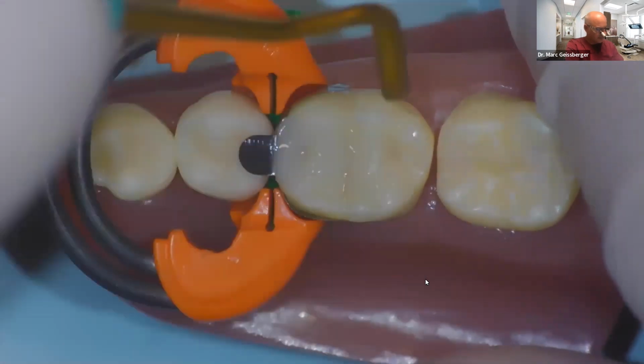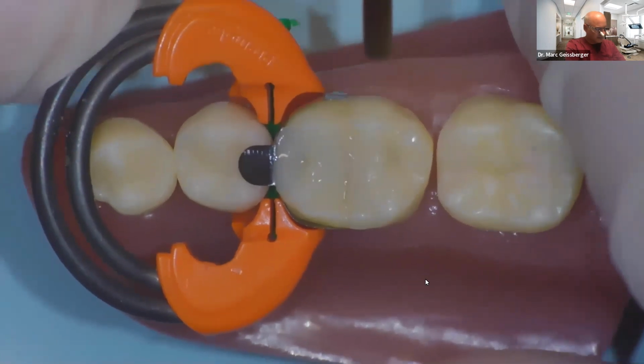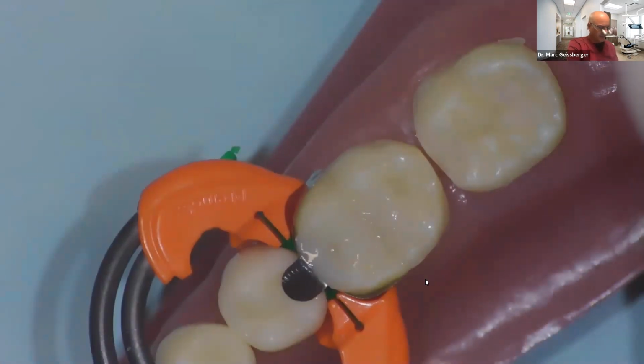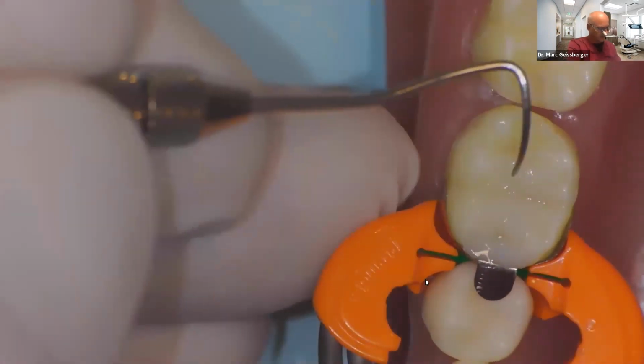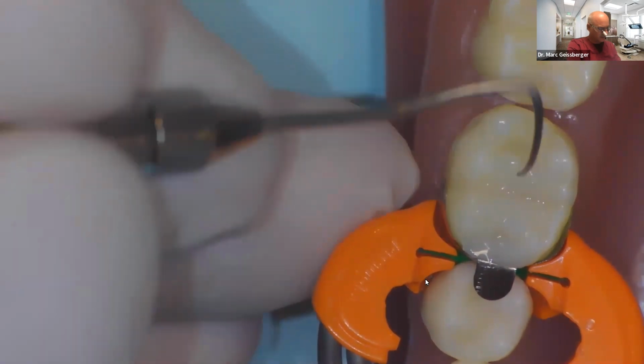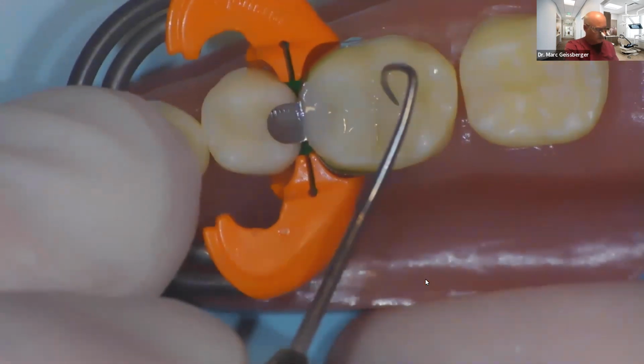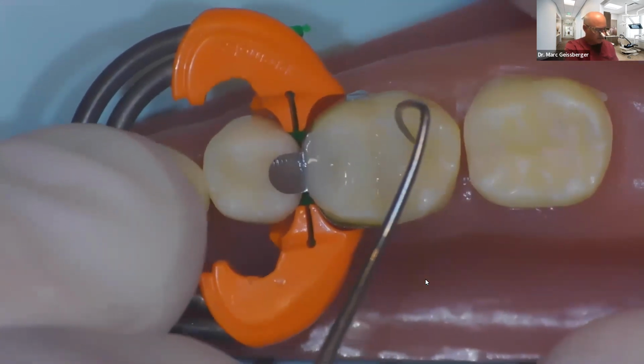What I showed you earlier, my nice way and what I tell patients is those restorations were uninspired anatomically. That's a polite way of saying they're not really nice. Come in here, get my groove. Come in here and get my triangular ridge grooves. And there we go.